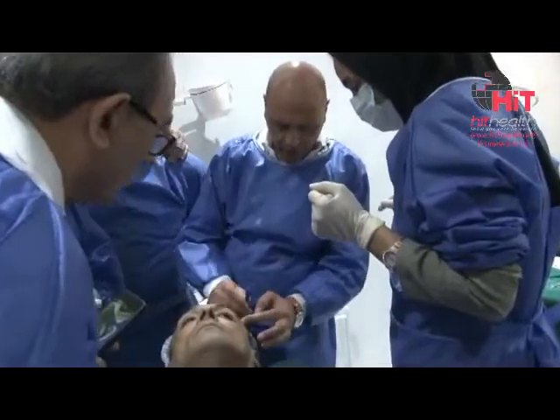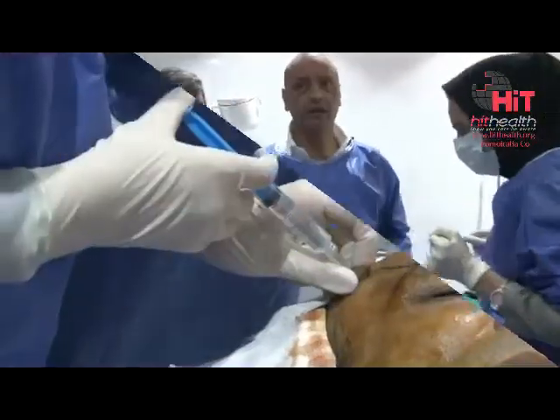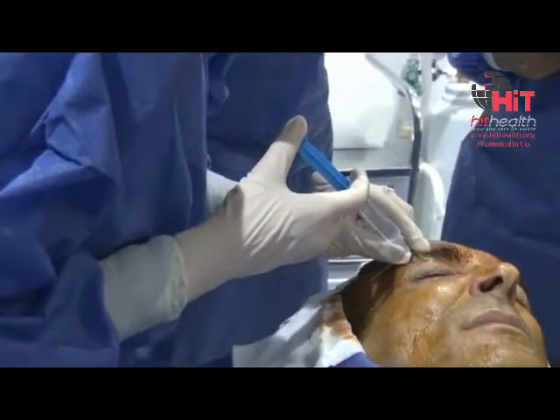After you can go into the epidermis — cut, cut, go, go. Okay, a little bit, little bit.